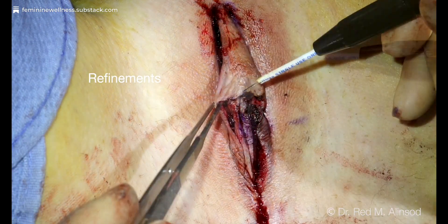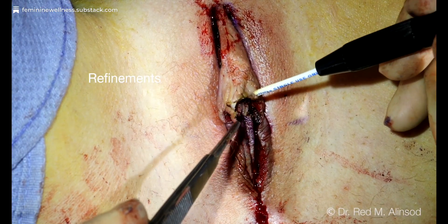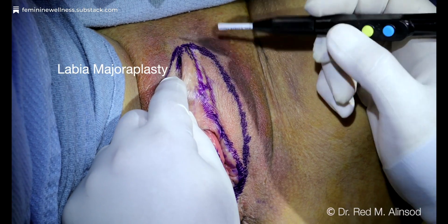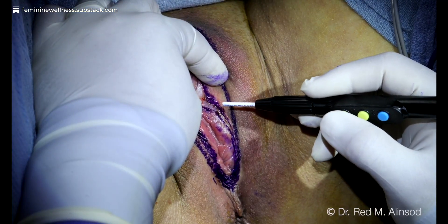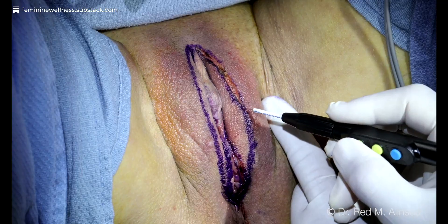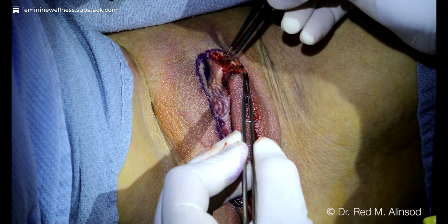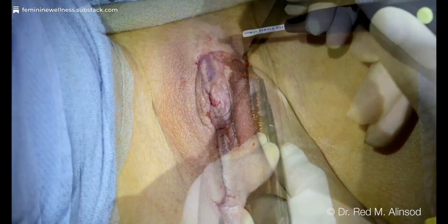If the hood is overhanging and too large looking, you can debulk this area too. You can trim the edge of the lower portion of the clitoral hood, make it more refined, and then close with very fine 5-0 sutures. These refinements can also be done for the labia majora. You can see me using the radiofrequency tip to incise over marked areas for a labia majoroplasty. Once you incise over the skin edges, you can remove the labia majora with unipolar or, as shown here, with bipolar cautery to control the bleeding. This is a little slower but there is much less bleeding when you do it this way.